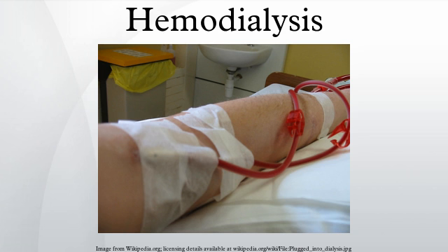Membrane flux and beta-2 microglobulin amyloidosis. High-flux dialysis membranes and/or intermittent online hemodiafiltration may also be beneficial in reducing complications of beta-2 microglobulin accumulation. Because beta-2 microglobulin is a large molecule, with a molecular weight of about 11,600 daltons, it does not pass at all through low-flux dialysis membranes. Beta-2M is removed with high-flux dialysis, but is removed even more efficiently with IHDF.